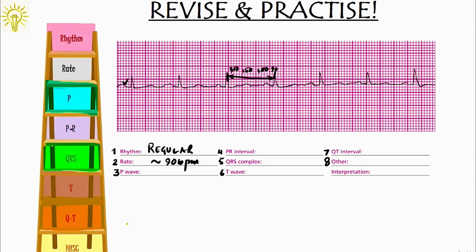The P wave seems normal, less than 2.5 millimeters and round. Its configurations are fine. There are no differences in shape. So, P wave is normal. The PR interval from start of P to start of Q has 3 to 4 small boxes. So, that makes it around more than 0.12 seconds, which is normal. The QRS seems normal. Its duration is less than 0.1 seconds, roughly around 2 small boxes. So, it's normal narrow QRS. The T wave is normal, less than 5 millimeters in size, round and normal configuration. So, T wave is normal as well.